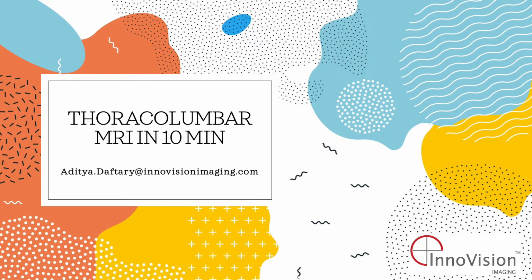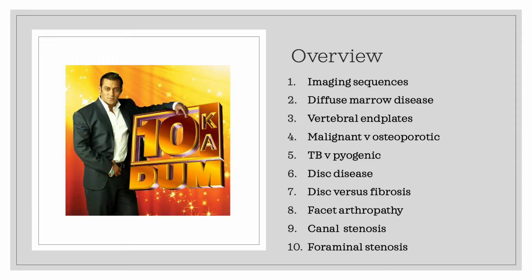Today's talk is on thoracolumbar MRI in 10 minutes. Like all orthopedic surgeons, we can't wait and get things done quickly. So today's session is called Das Ka Dam, and we'll be talking about 10 different things that I find would be useful for all of you during reading MRI of the spine.